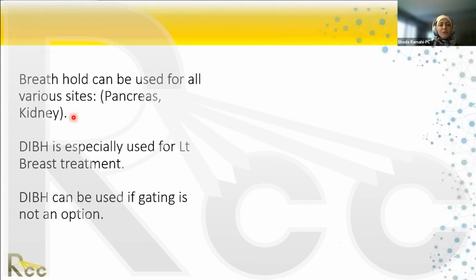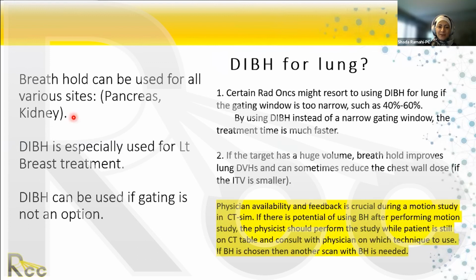So as I said, we do breath hold for a variety of sites. And if you remember, in the second or third lecture presentation, someone mentioned they don't do the DIBH for lung. In fact, in our institution, one physician sometimes does the DIBH for lung, and the question is when. I asked him to write me a small paragraph about when he considers DIBH for lung, and this is what he sent to me.